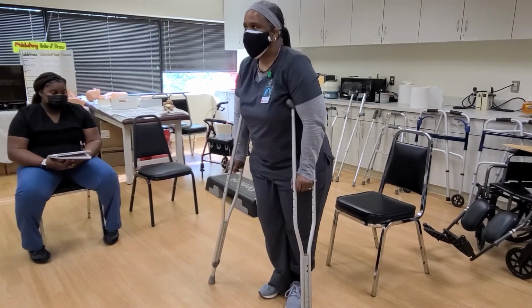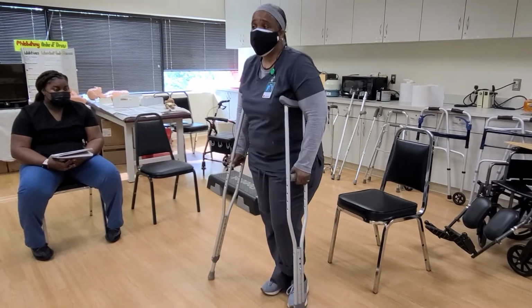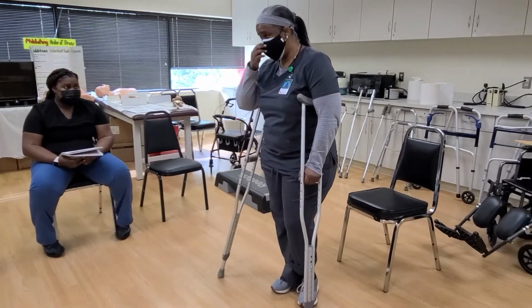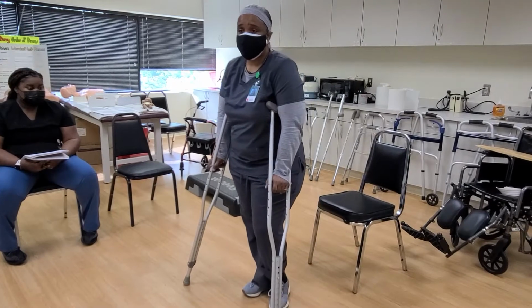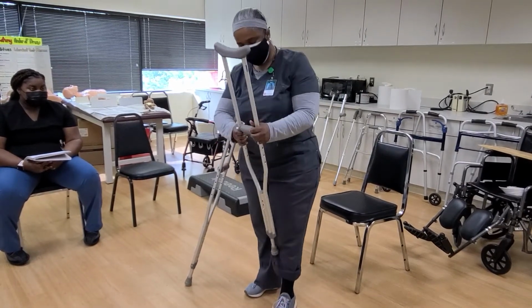Now, one thing is they should have asked me, have you ever used crutches before? What are your balance issues? Because I would have told them, I have vertigo. So I'm probably not the person you want to give this to, which I really experienced shortly thereafter. Let me tighten this up a little bit.